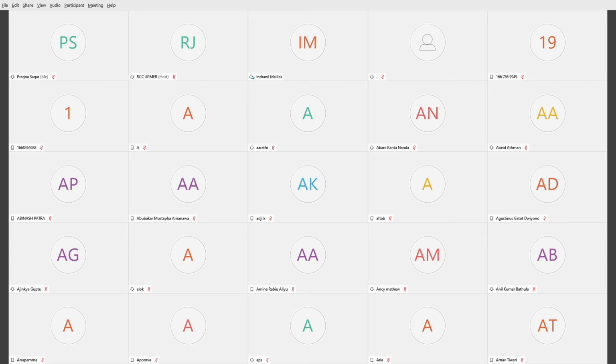But the moment you take the patient from one machine to another machine, and the second image takes place half an hour later, because of the difference in the bowel and bladder, the prostate will rotate along the lateral axis, so it'll kind of swing forward like a pitch. So I feel it's quite difficult to fuse really an MR with a CT scan. So I have never even tried, but there are many people listening who have probably worked in departments where this has been attempted, you can share your experience. But I wouldn't take that effort. I think that I would rather use common sense.